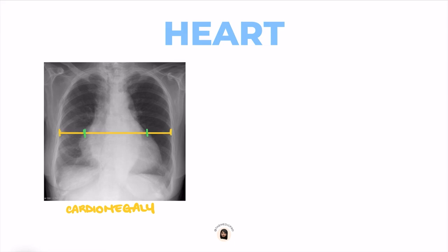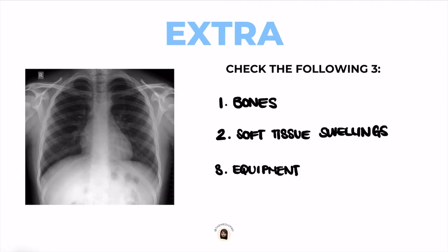This is what cardiomegaly looks like — you can clearly see that the heart's diameter is way more than 50% of the cardiothoracic diameter. Finally, we check extra features, which are three final things. Number one, the bones — look at the clavicles and all of the ribs to check for any fractures. Number two, check for any soft tissue swellings in the x-ray. Third, check for any equipment you can see, for example a pacemaker, a feeding tube, or a nasogastric tube — you want to check their location and make sure they're in the functional position.